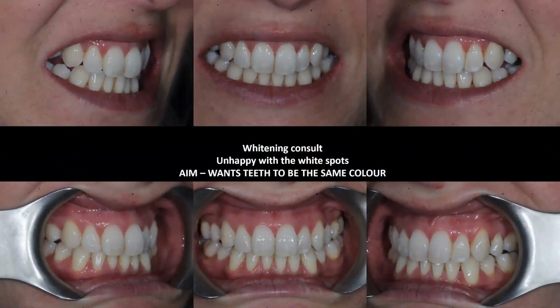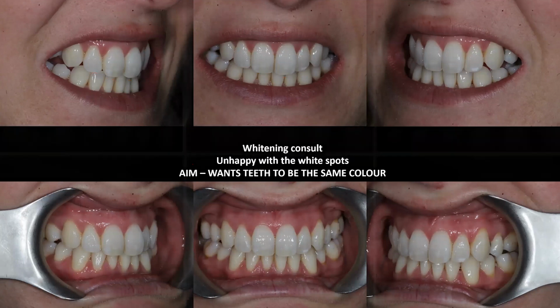So here's a case that I've seen. She actually came in for a whitening consult, this lady. But what we found out from her was actually she was unhappy with the white spots on the teeth, these little spots here. And her main aim, and it's always really important to get this aim from the patient, is, what do you want to achieve from this? She just wants her teeth to be the same color. And so that's a really important thing to take forward with the options that we discuss.